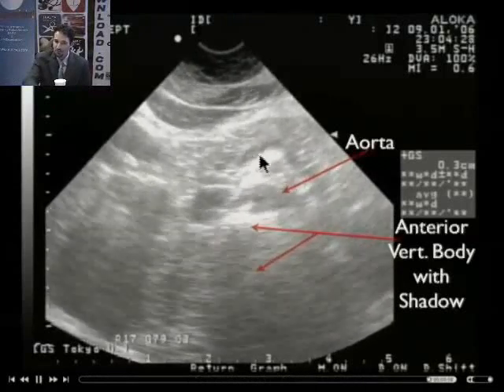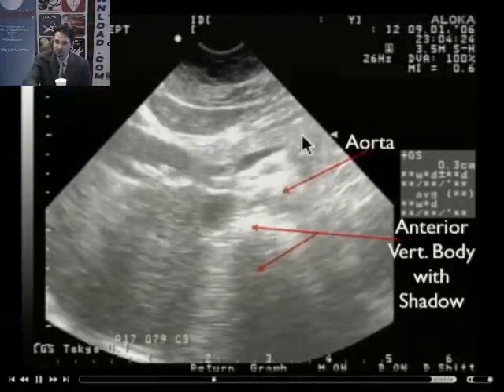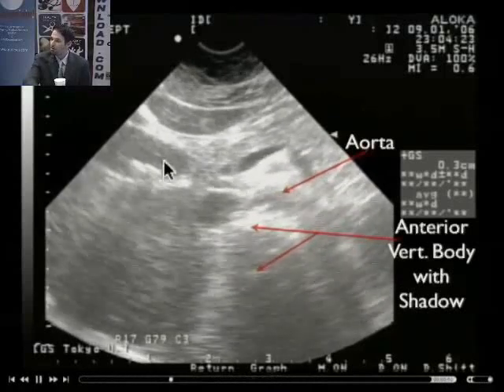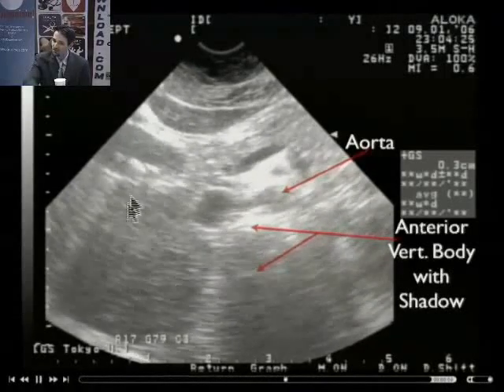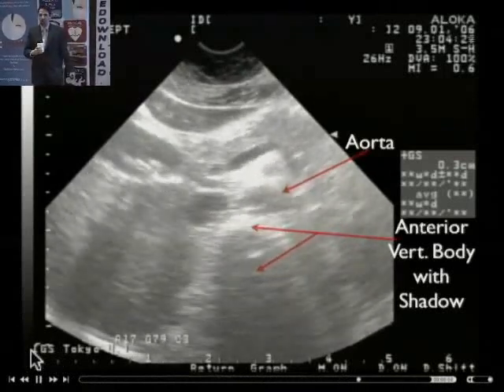This happens to be the splenic vein. Right above that is the pancreas. And this is a bonus clip. We happen to have a gallbladder right here with some stones in it, casting shadows. It wouldn't be a county patient if it didn't come fully equipped with gallstones.